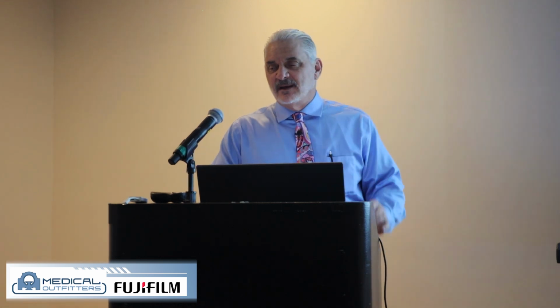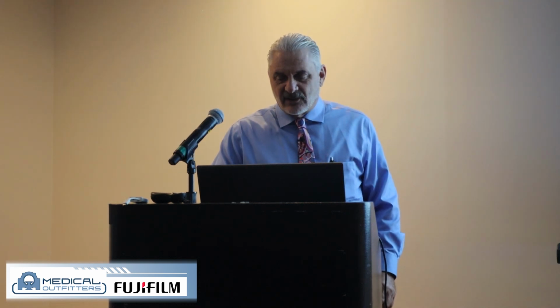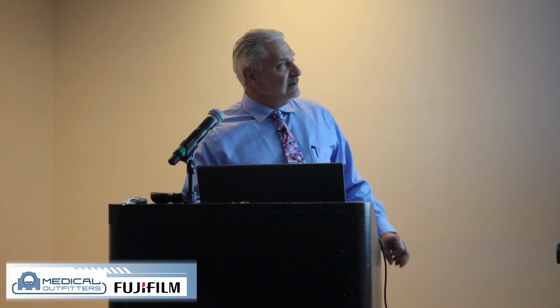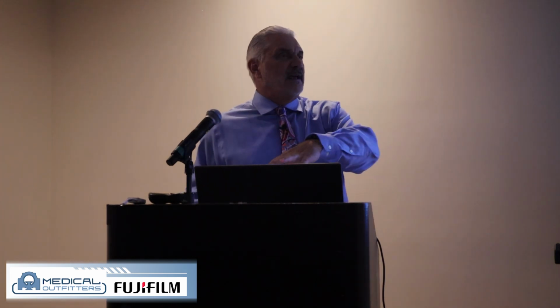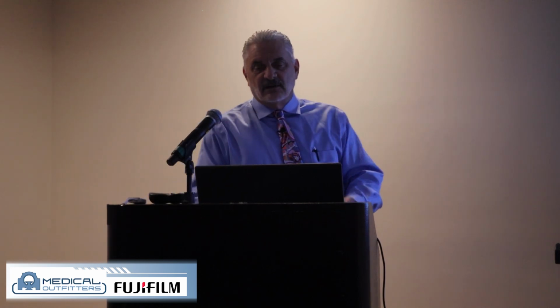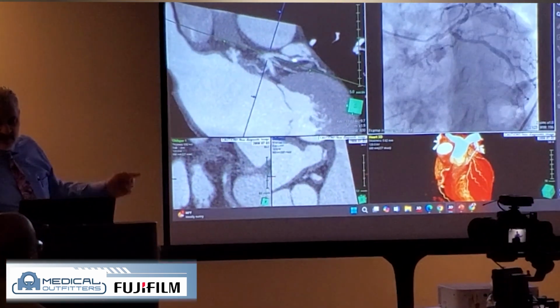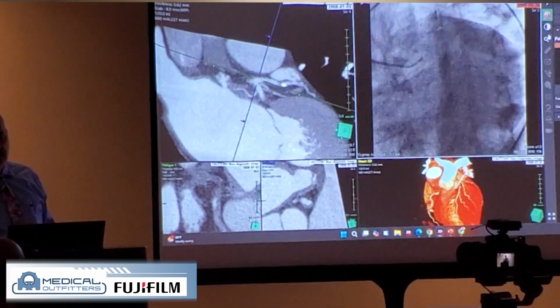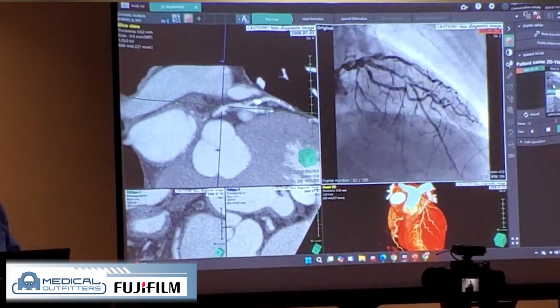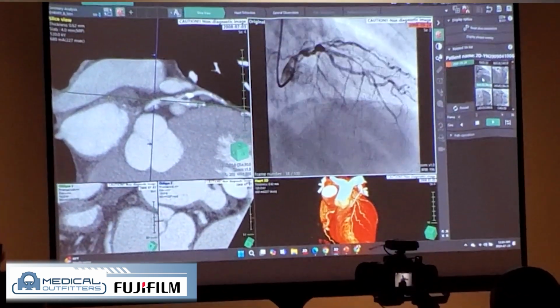So with that being said, I'm going to move on to some imaging and show you just how 3D is involved in this, right? I loaded up a single phase. I can also pull in the angiogram as well, so I can evaluate the angiogram and the CT at the same time. Up in the top right viewport, you can see the angio. Over here are the coordinates of the cath lab, and each of these is a different position in the cath. If I click on that, it brings the CT to the exact same position that's represented on the cath.